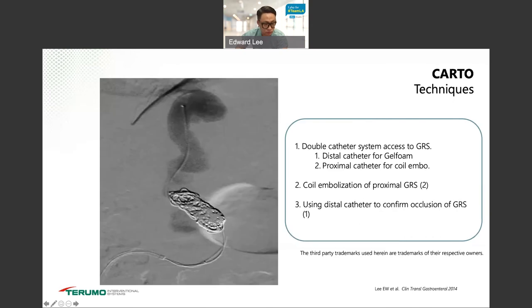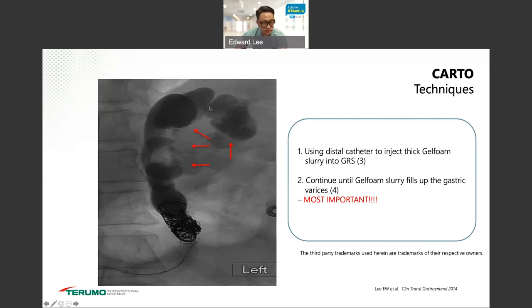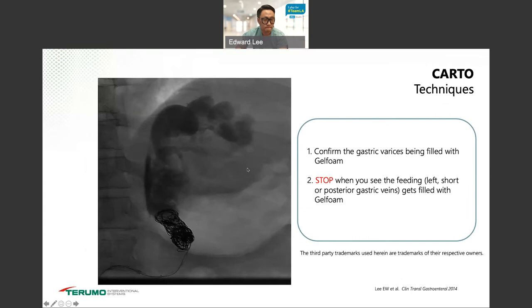You have a second catheter placed proximally. The distally placed catheter and the proximally placed catheter work together. You embolize coils to completely occlude the draining vessel, then through the distally placed catheter you inject gel foam. The gel foam settles into the coil, fills the entire shunt, and goes through the communicating junction into the varices. It's critical that you embolize the entire varices as well as the feeding vessel.